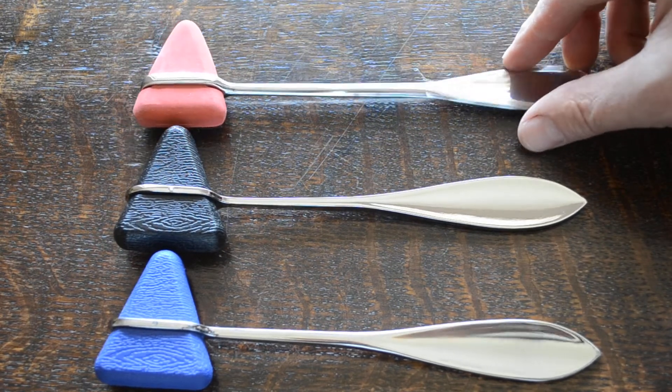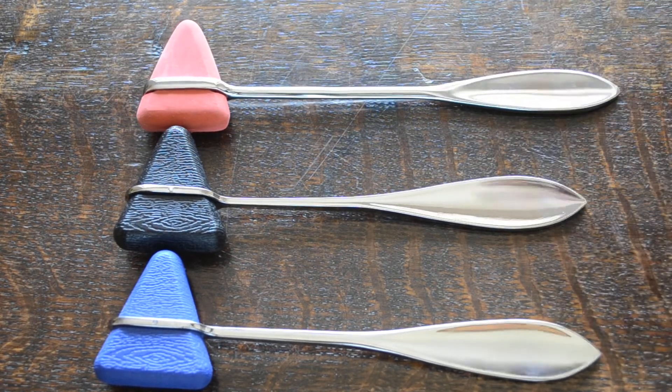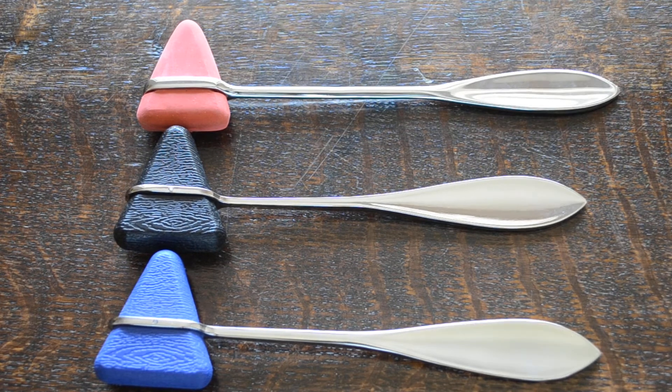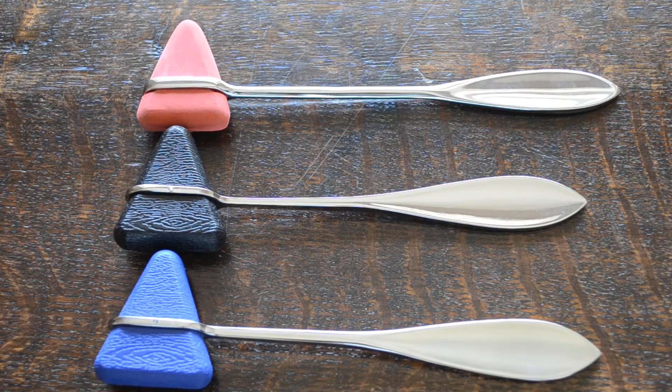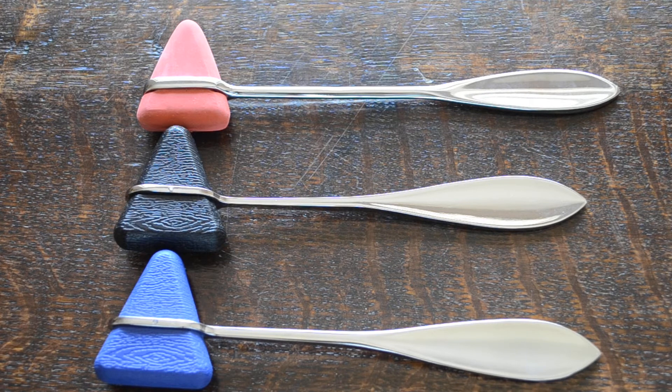So those are the three options that you've got if you're considering buying a Taylor's reflex hammer. They're all available for between three and four pounds. They're not expensive units to buy so they can be replaced as required.